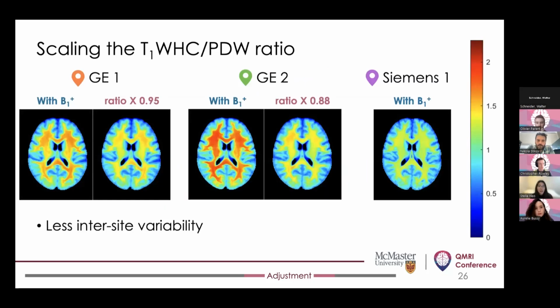And when we looked at the site average R1 maps, we saw the same results. Globally scaling the ratio values makes the site average R1 maps a lot closer to one another, but we do still see some site differences in these maps. But because the scaling factors we used were quite rough estimates at the moment, we do believe that these results seem to support the notion that there may have been some vendor-specific and site-specific scaling of the images going on in the background.